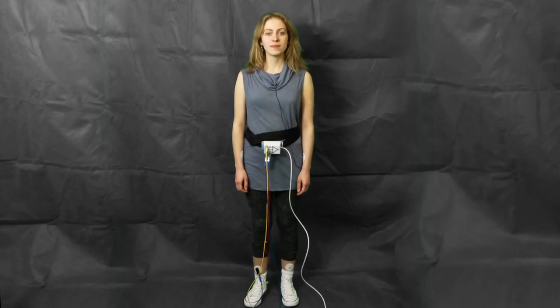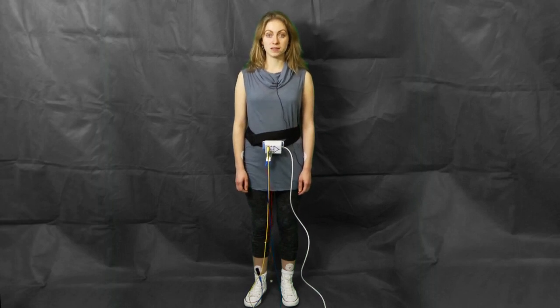Hello. Today I'm going to show you how to record my ECG with the augmented limb leads called aVR, aVL and aVF. With these additional limb leads, it is much easier to determine the mean electrical vector.